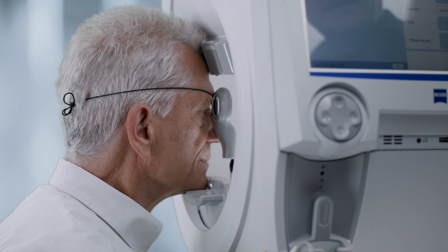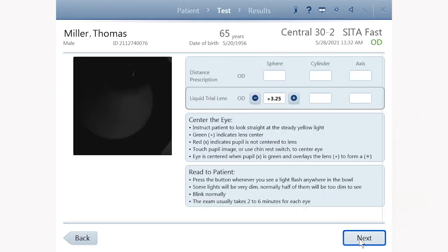Move the trial lens as close as possible to the eye without touching the lashes. When you are ready to start positioning the patient to the trial lens, touch the next button to go to the setup screen.